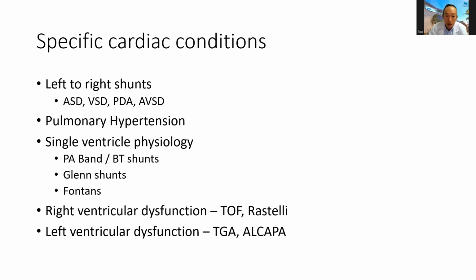I guess how we want to look at it is dependent on what we want to achieve. If you want to promote more blood flow to the lungs, you try not to use too much pressure in the lungs: lower tidal volume, lower pressures, higher oxygenation to promote more blood flow to the lungs. If you do not want blood to the lungs, then you push pressures a bit higher. You get what I mean? Yeah, thank you.